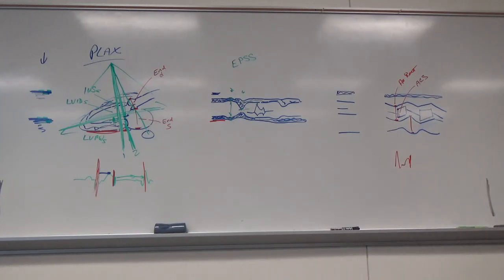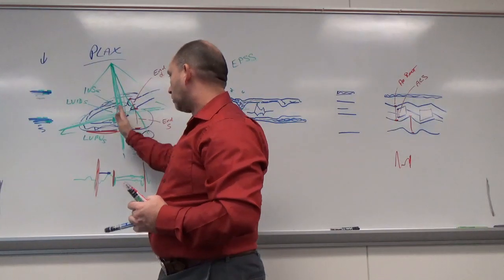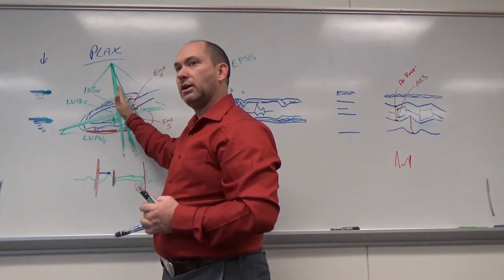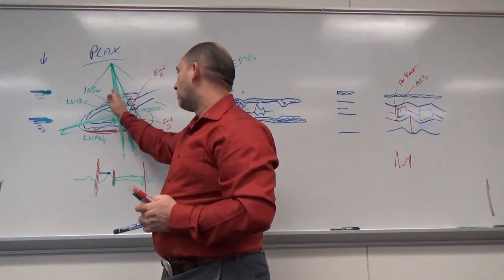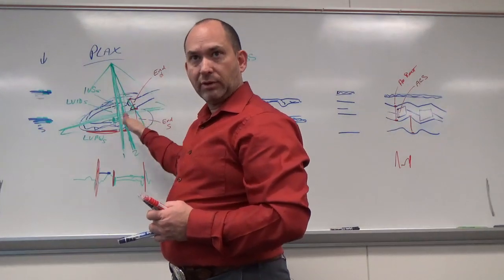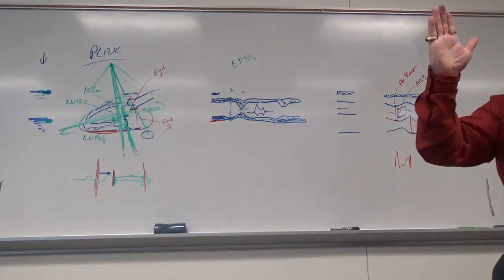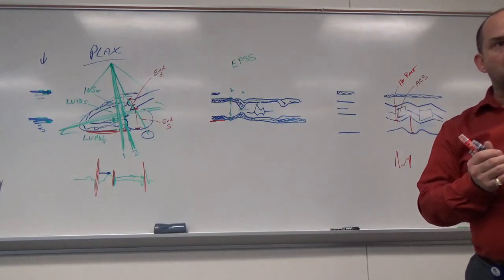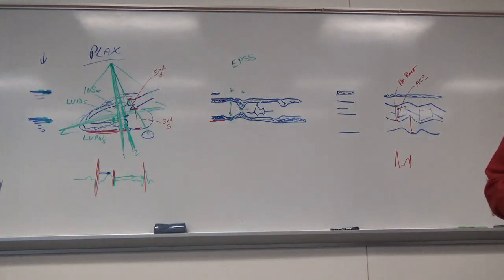Again, these can all be done from short axis as well. It doesn't have to be done just in long axis. So what we typically do is get a parasternal long axis view. You'll put the cursor through, you'll take it at the LV, you'll take it at the fish mouth or the tips of the mitral valve leaflets, and then you move it to the aortic root through the aortic valve in LA. If I go in short axis, instead of moving my line, I can actually just sweep down. So you can do it either way, and it helps you make sure that you're right in the center of it.